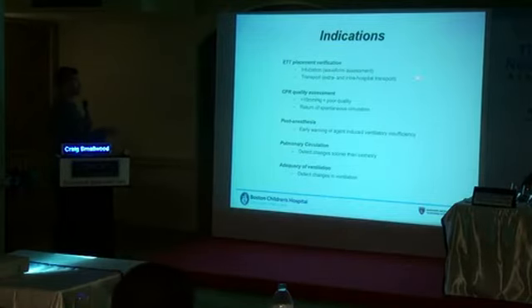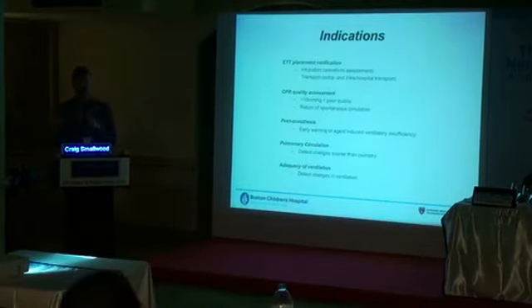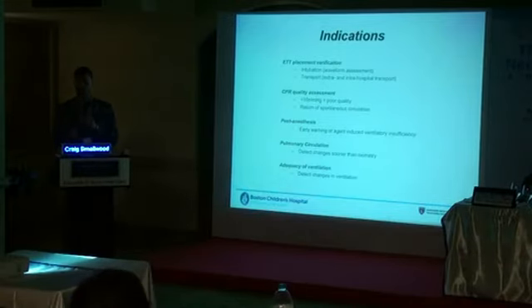And also in transport, and that's really just a safety thing, we actually monitor on 100% of our intubated patients, unless they're a really small newborn who we're not really comfortable with putting a large adapter on their airway. It can be a little bit cumbersome depending on what the device is you're using to aspirate a CO2 sample. But if the baby's just too small, sometimes we'll just spot check it a handful of times a day.